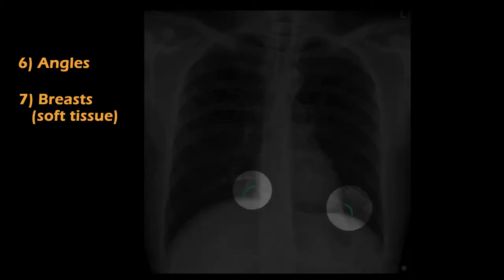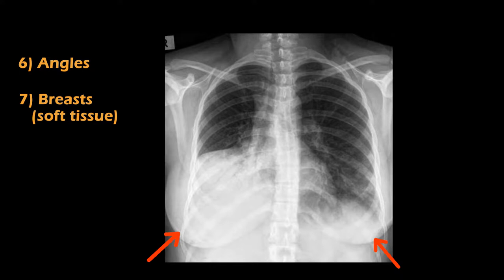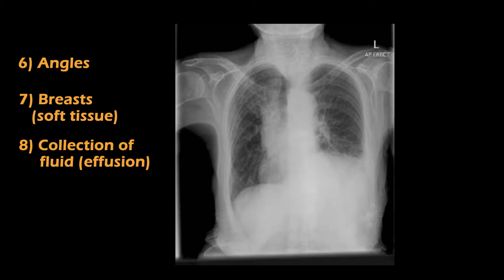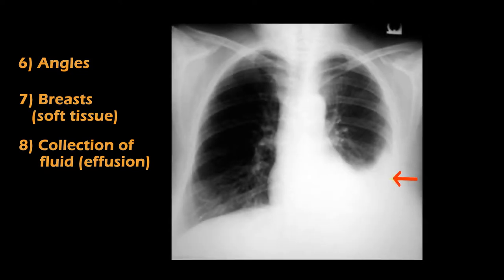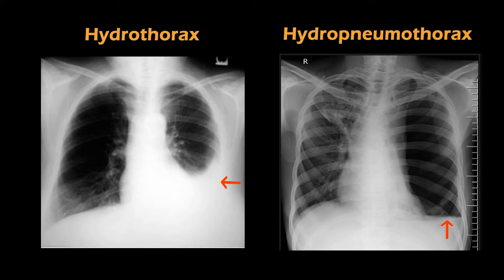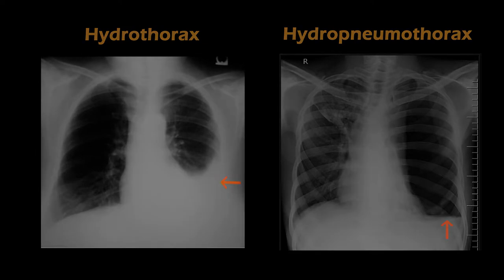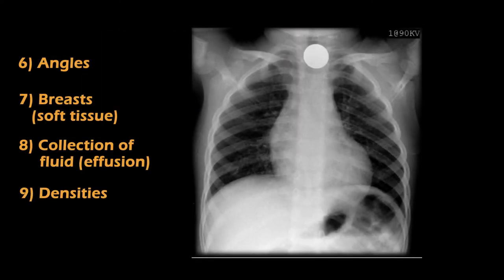B stands for breast or soft tissue shadows — this is how a breast shadow is seen. C stands for collection of fluid, referring to effusions. This is an x-ray of pleural effusion — look at the obliterated costofrenic angle. In pleural effusion, the first sign noted on chest x-ray is the obliteration of the costofrenic angles. Another important finding is hydrothorax, which is seen as a curved line; it is important to differentiate it from hydropneumothorax, which is seen as a straight line. D stands for densities — it may be an enlarged lymph node, a tumour, or any foreign body. This x-ray shows a foreign body in the chest, noted as a radioopaque density. This x-ray shows an irregular mass in the chest, which may be a tumour.